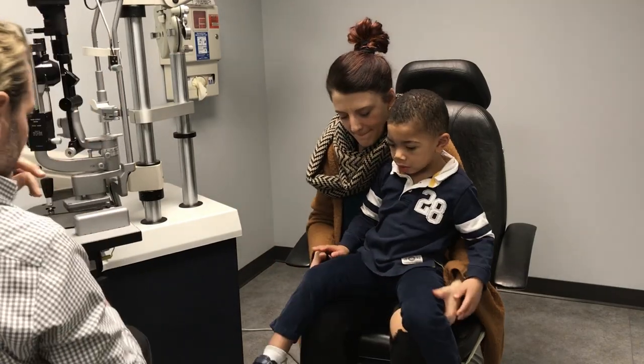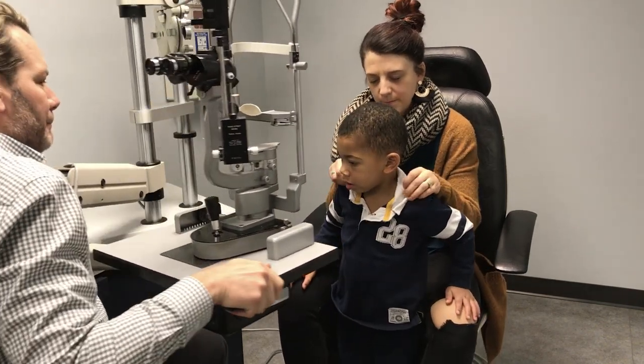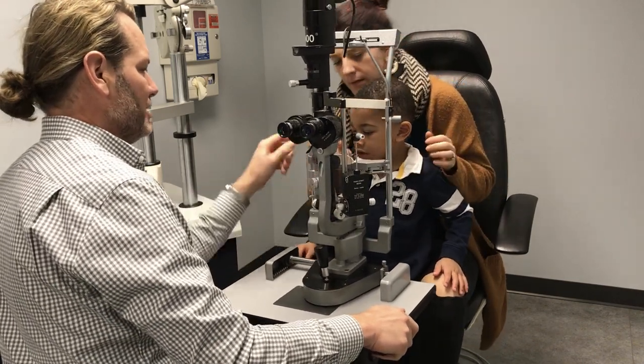Stand up between mom's feet for a second. We'll go for a little ride here for a minute. Up, up, up. Now rest your chin right there. Can you rest your chin right there?